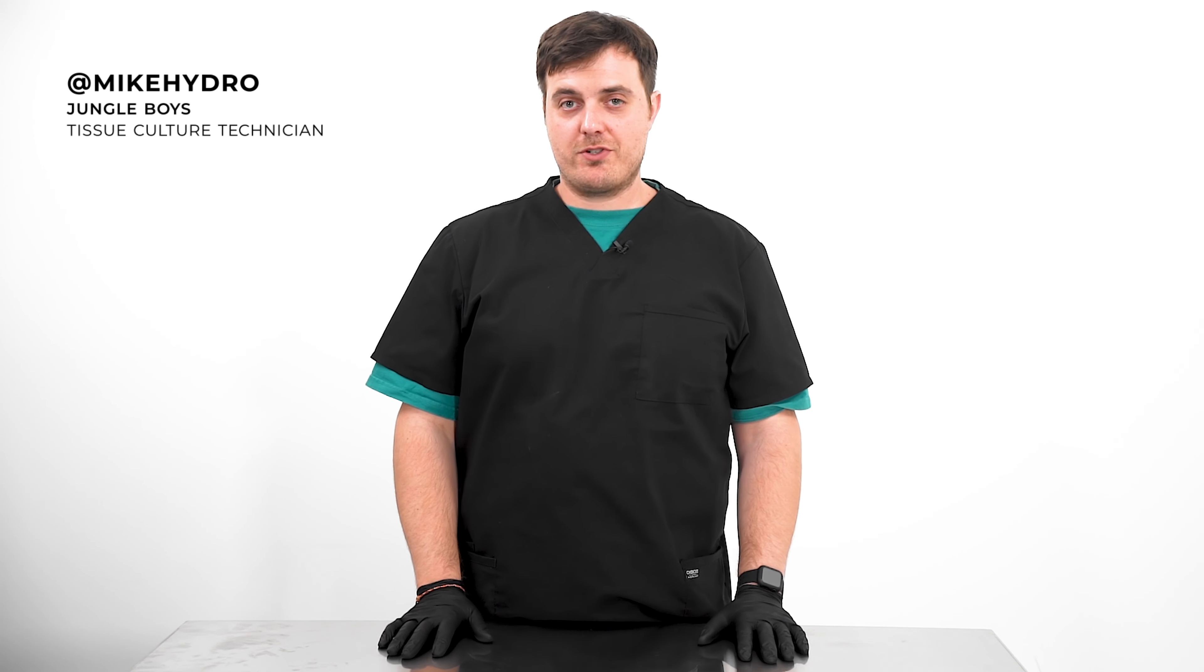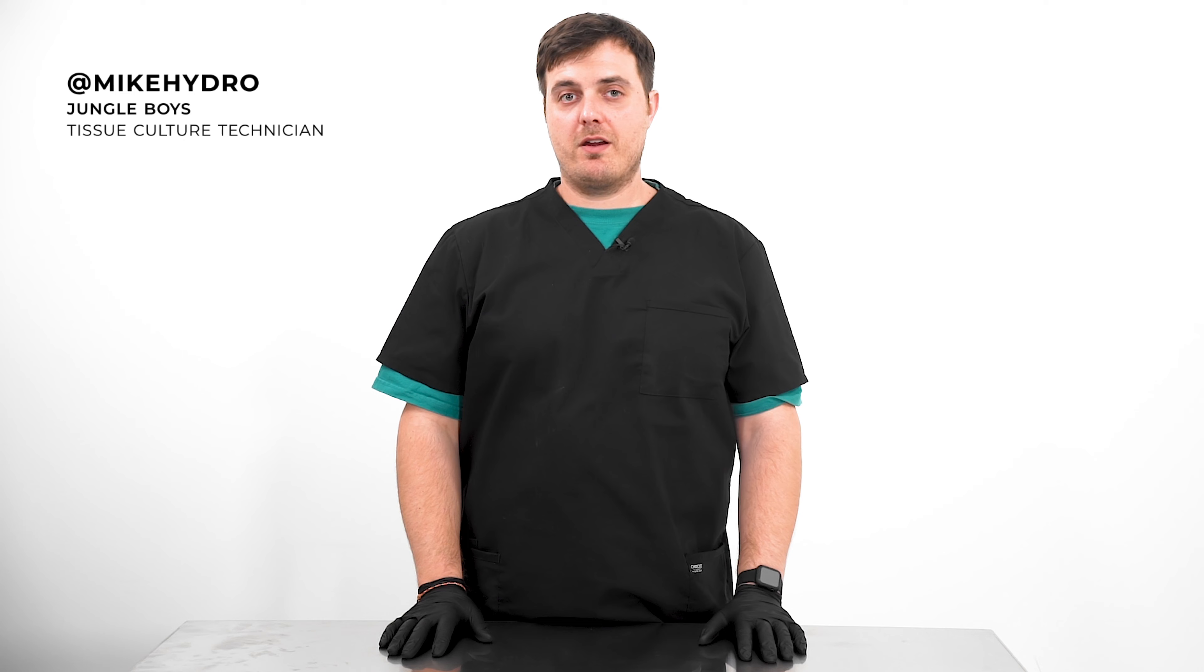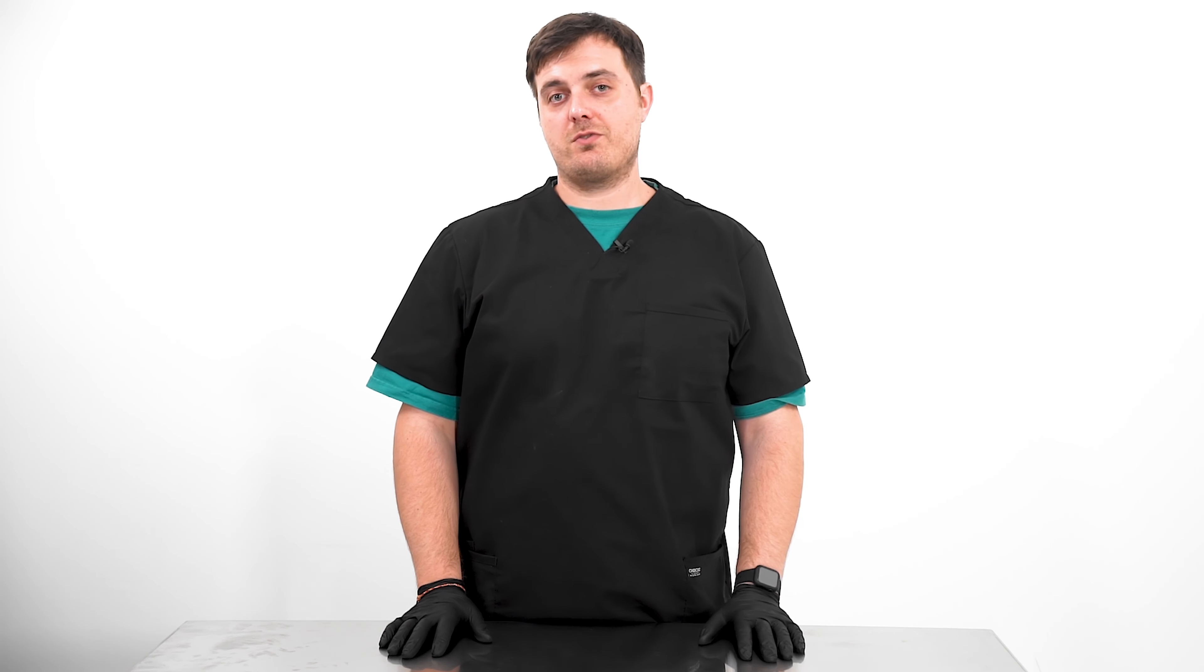What's up, Athena family? I'm Mike Hydro from The Jungle Boys here to demonstrate how to prepare our Roots & Shoots media using the Athena Tissue Culture Kit.